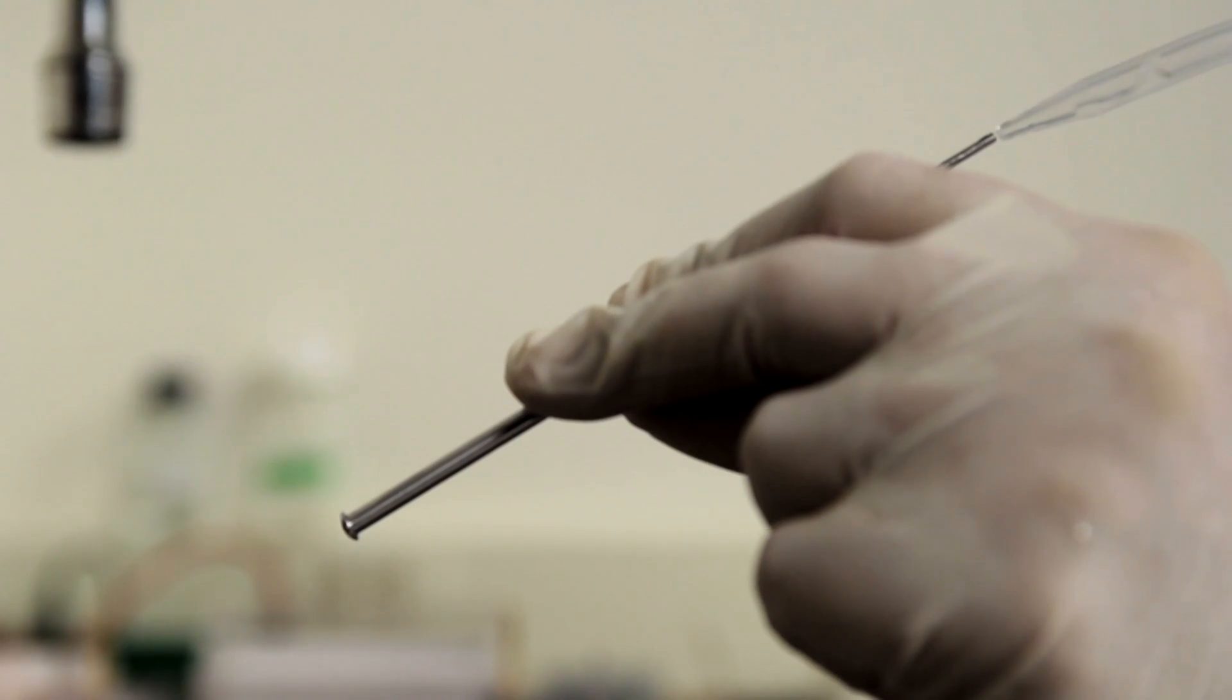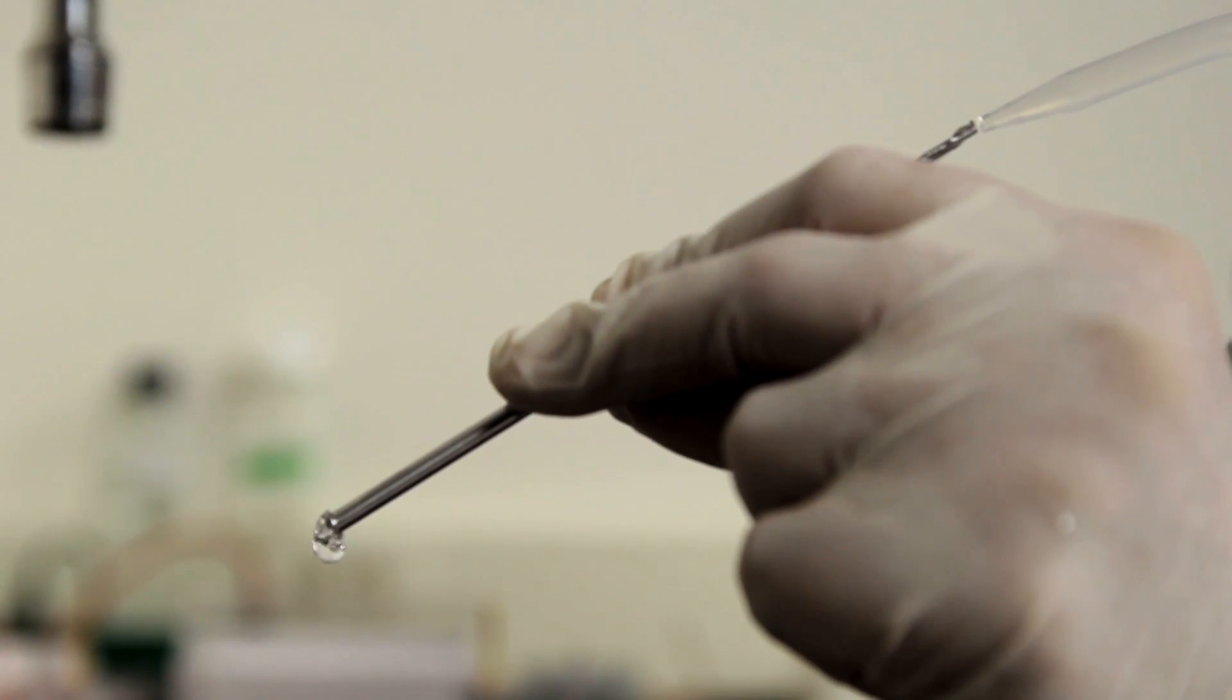Needle cleaning is quite simple. First, let's make sure the needle is not clogged. Using a syringe or squeeze bottle, flush the needle with distilled water from the narrow end.